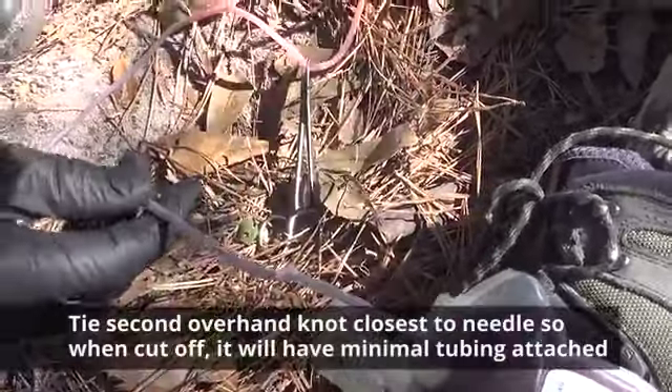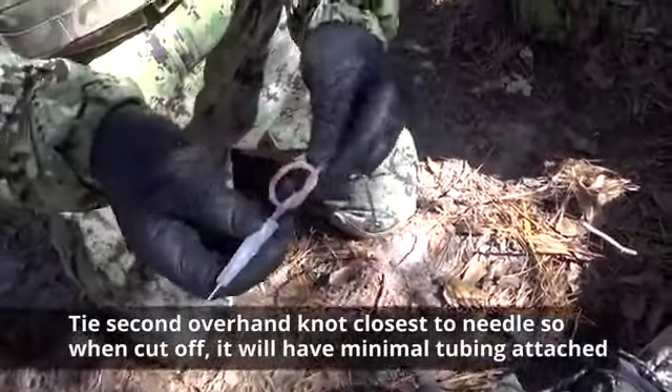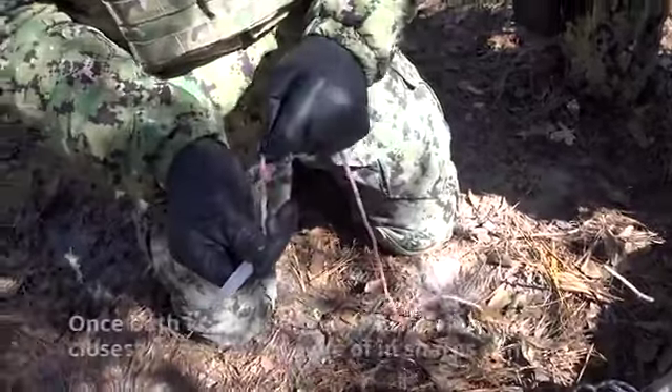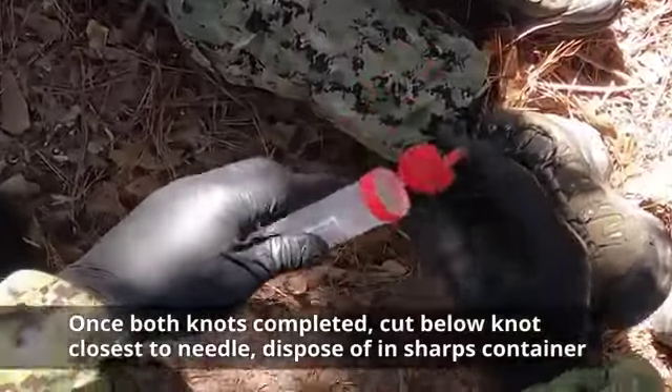Then tie a second overhand knot closest to the needle, so when the needle is cut off it will have minimal tubing attached while still maintaining proper control of the needle. Once you have both knots completed, cut at the knot closest to the needle and dispose of the needle and tubing in a sharps container as appropriate.